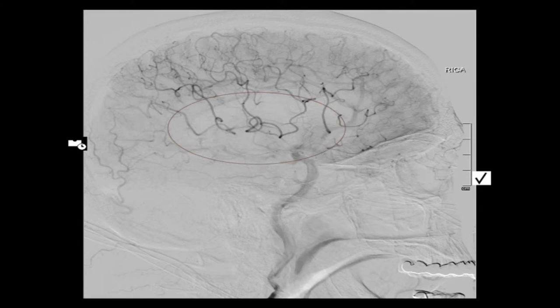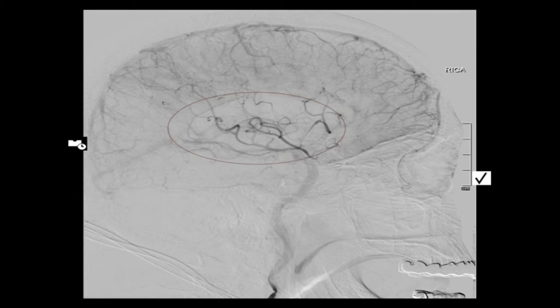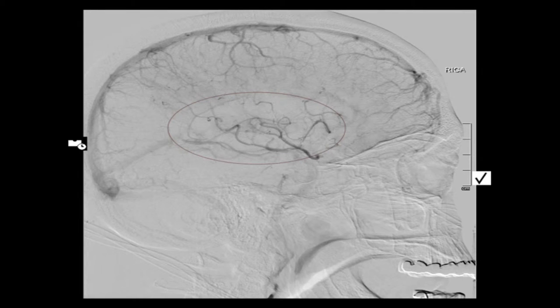There we go. So now watch these collaterals come around. So that's what we're looking for, the non-contrast head CT. It's not dark in this patient, there's no completed infarct, there's no edema, because these collaterals are keeping up. And with the CTA multiphase, the next one I showed you with the collaterals, the phases in this one would probably be giving them a score of four, maybe three. It's not perfect because it's not so fast that you can't even tell the difference, but it's fast enough that he has a good score.